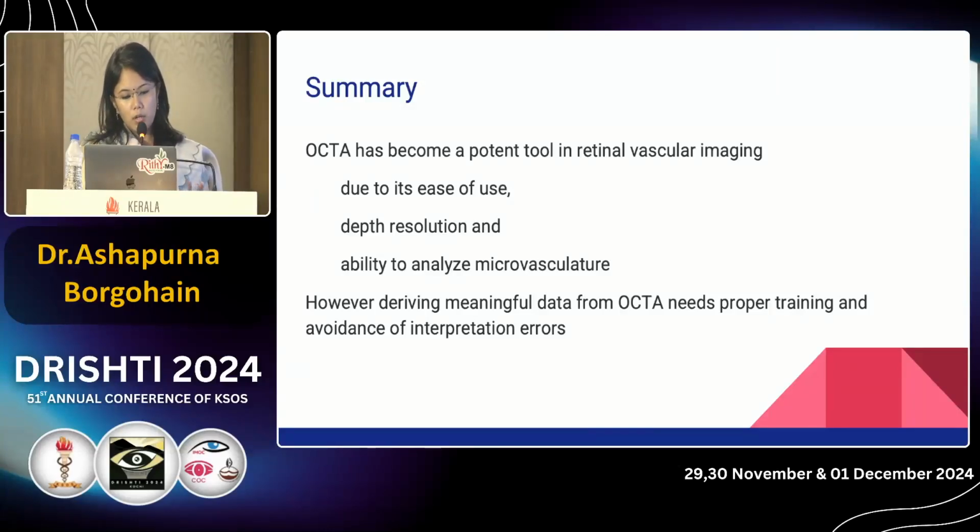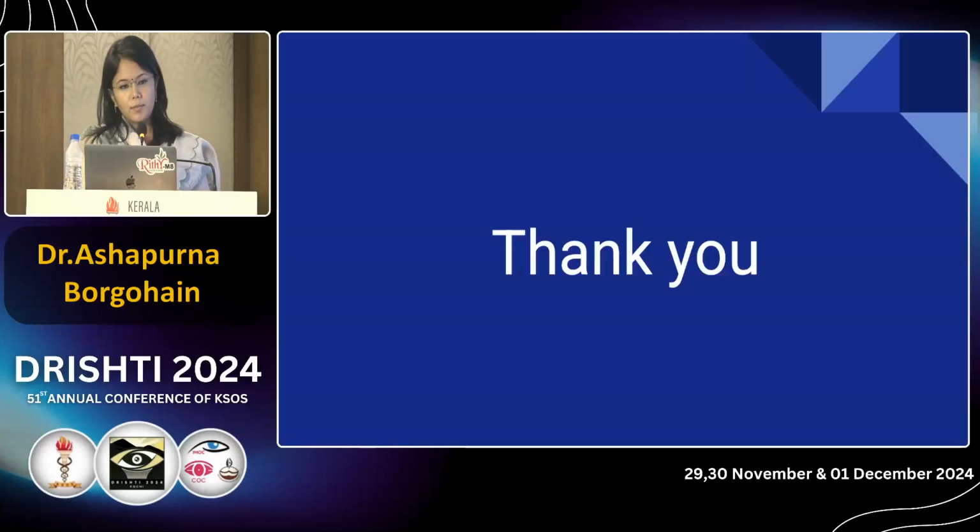So coming to an end, OCTA has become an important tool in retinal vascular imaging. However, we should be aware of the different artifacts, and we will get meaningful data from OCTA only if we know about the artifacts and have some proper training. Thank you.